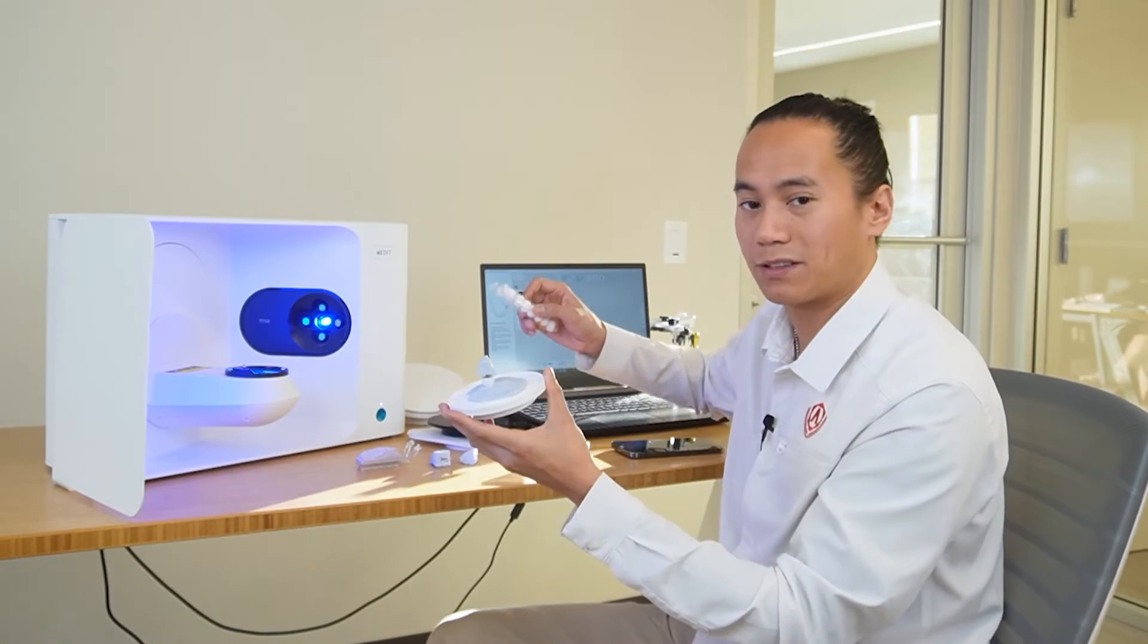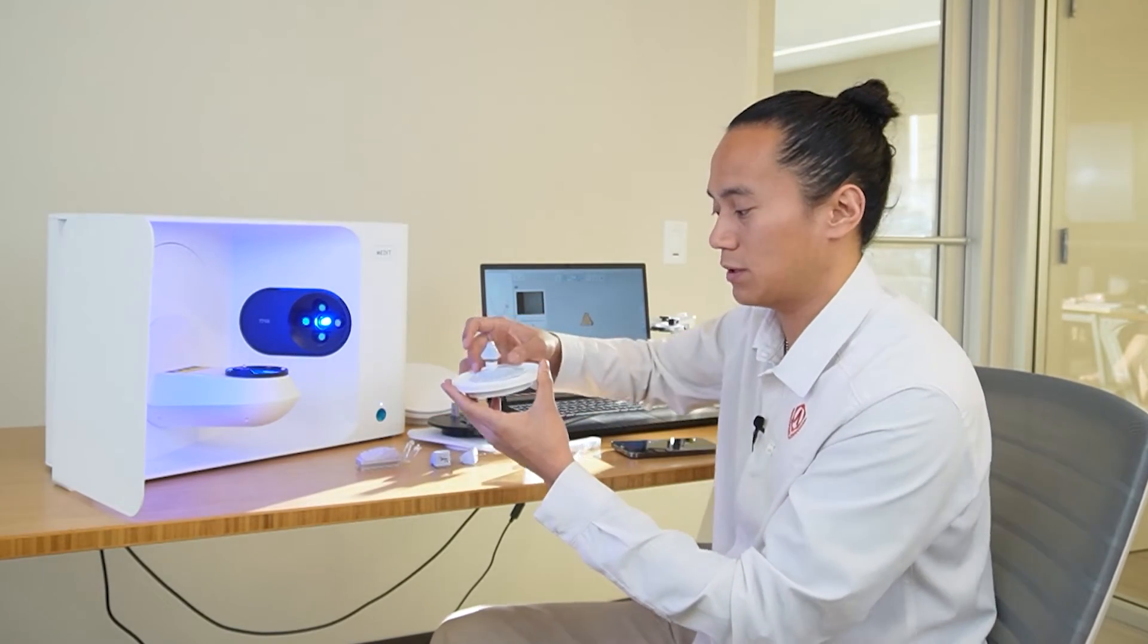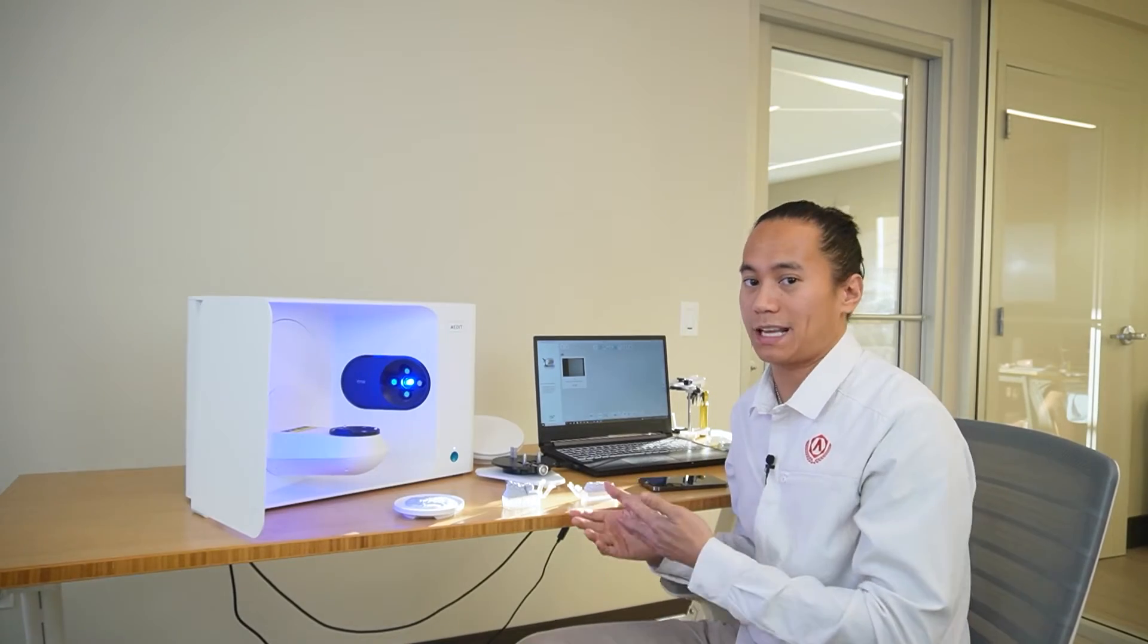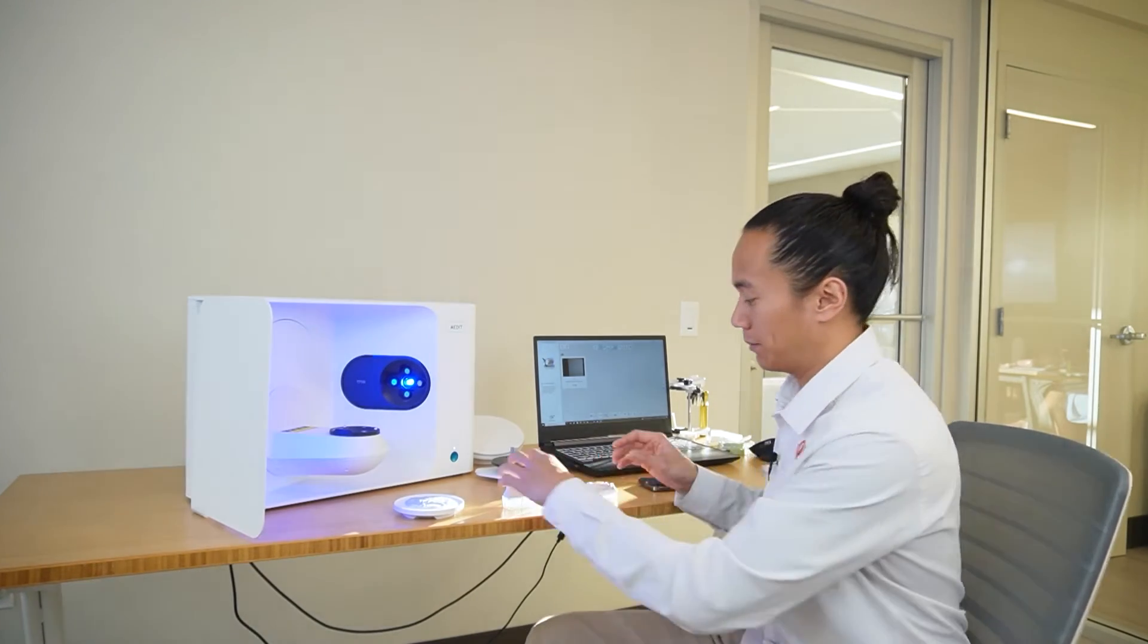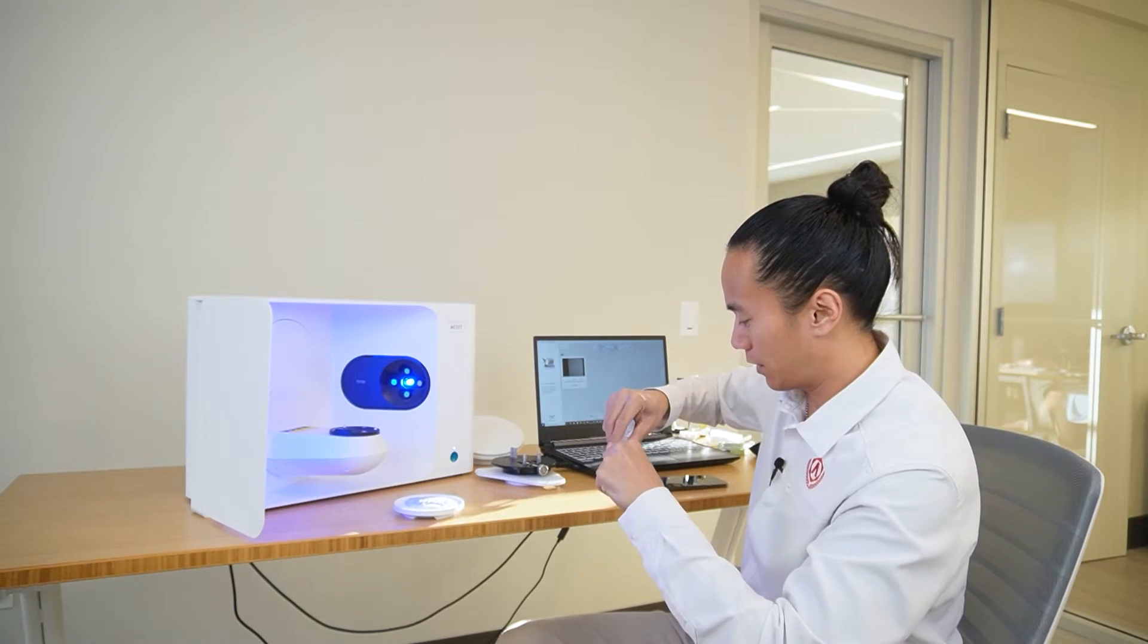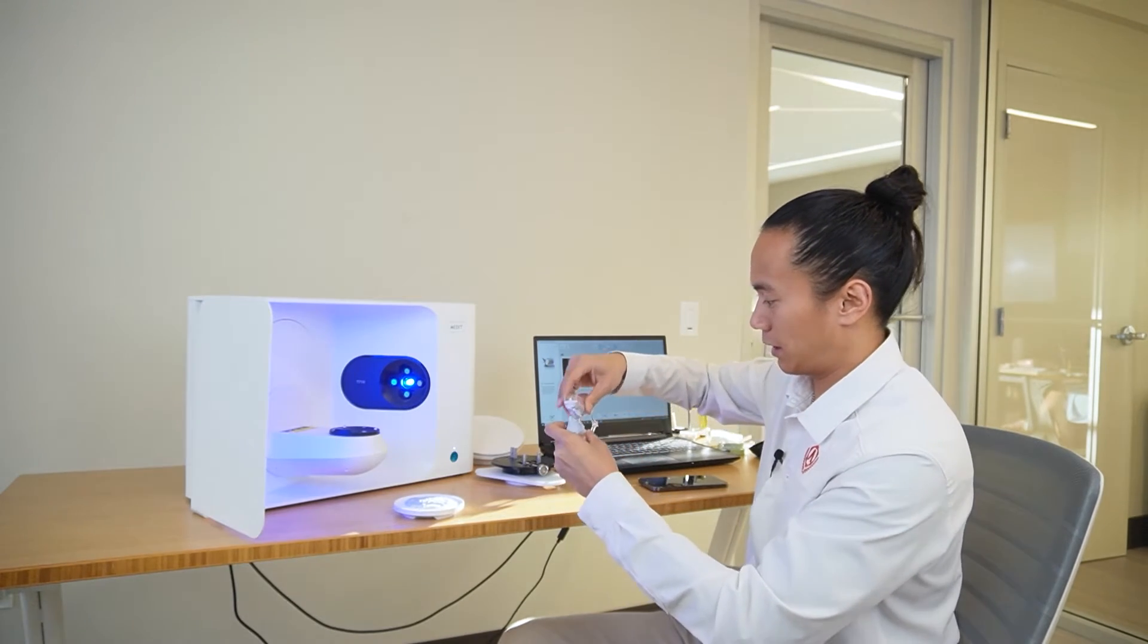Now again, if you don't have the die holders handy, you can always just use an excess amount of blue putty as well. The last step in any scan process is to scan in your bite. For this specific quadrant, we'll place our articulator back together. Just like that. Now note, we're just going to use the same plate that we've been using with the putty.